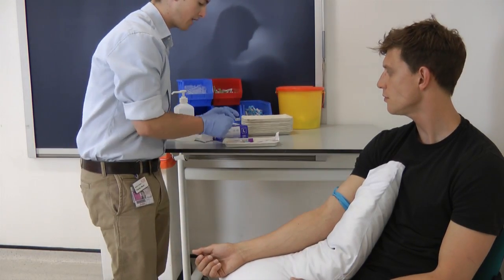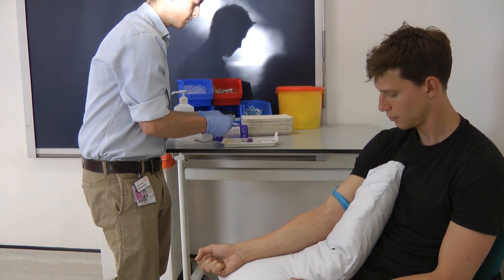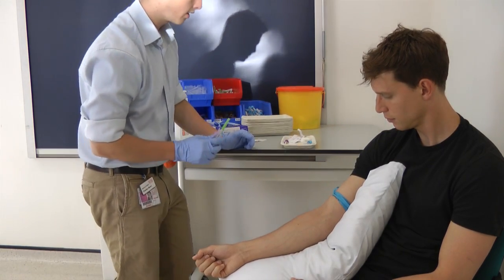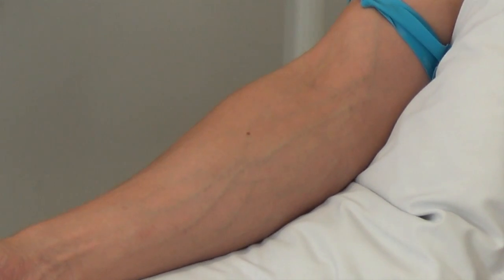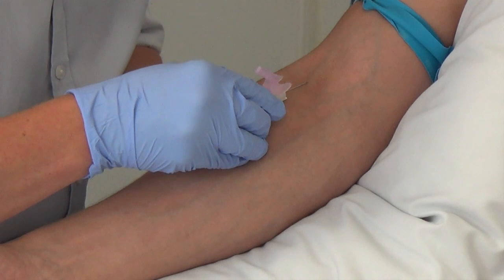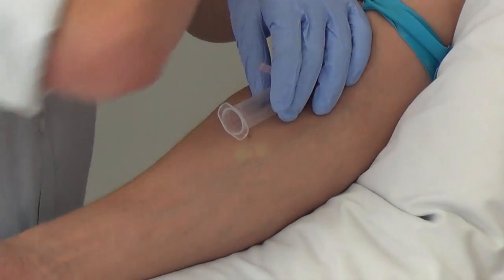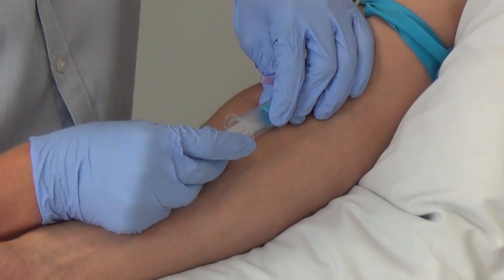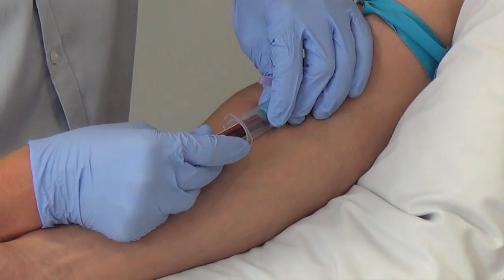During this time I can assemble my vacutainer needle and holder. So if you're ready, I'm just going to put the needle in. You'll feel a sharp scratch — it shouldn't be painful. As you can see, the vacutainer begins to fill with blood. With the blue one, it's particularly important that it's filled right to the top. Next comes the gold or yellow top.